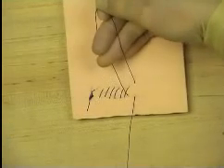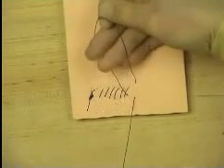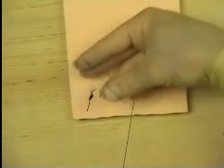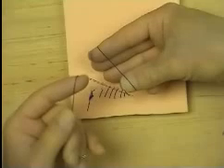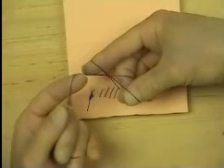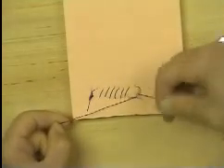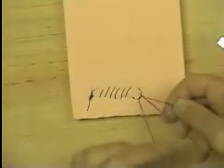After forming a continuous monofilament suture, it is necessary to use an Aberdeen knot for termination. Once the last bite has been made through the tissue, the suture is not pulled all the way through, leaving a loop through which the fingers of one hand can be passed.